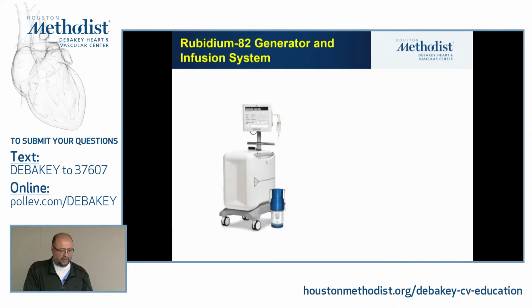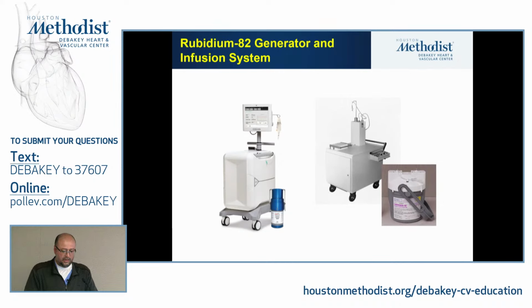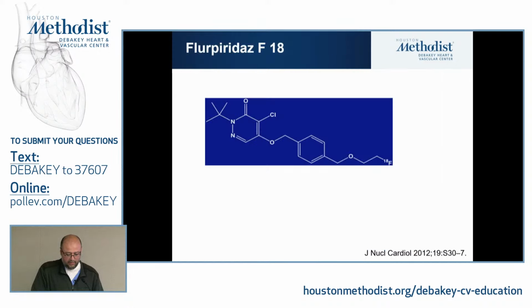So these are some of the images. This is the one that we have, and this is the old generation system from the other company, and it will allow you to inject and get perfusion data with that. And we talked about this.